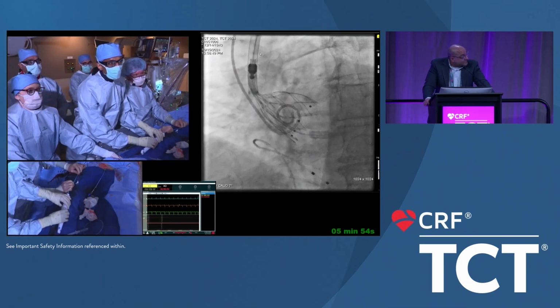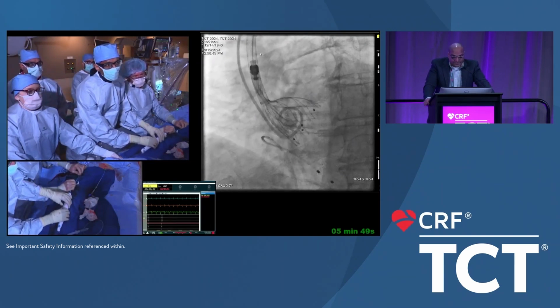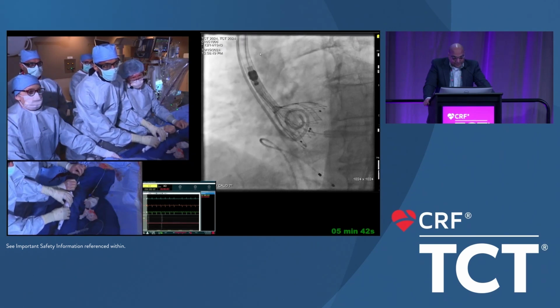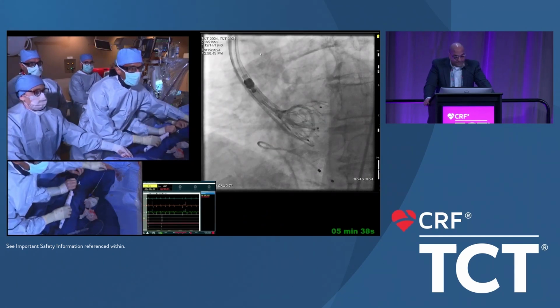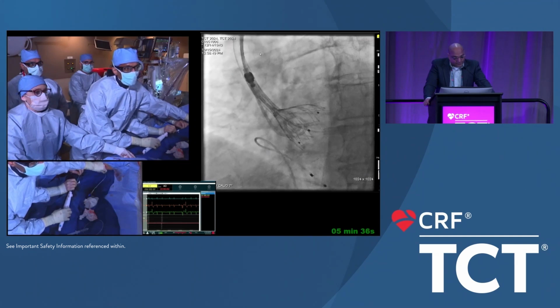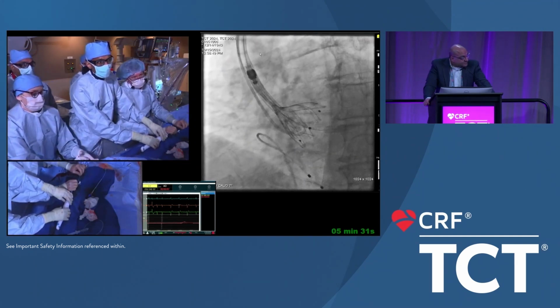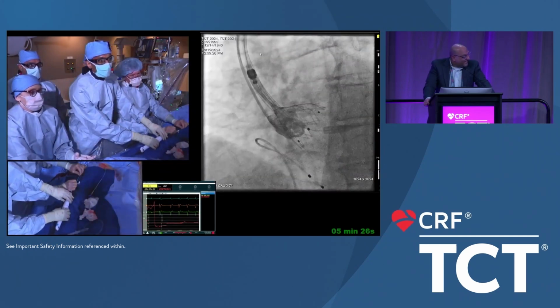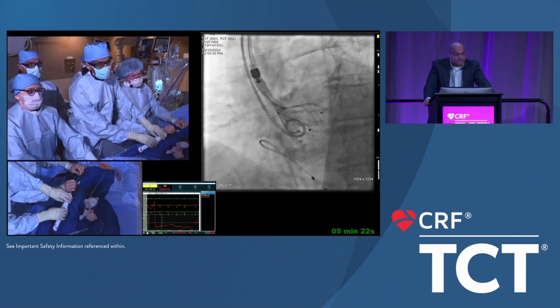So actually, I was in the number one position, but if you look at the pressure, I've got some forward pressure. And if you look at where that left cusp is, or where that valve is, you're at a 0 on the left side. I thought it was a little aortic. So we were concerned about it, and part of that probably is my fault. Yeah, it's probably all my fault. But in this case, we felt like we could maybe do a little bit better and recapture this.